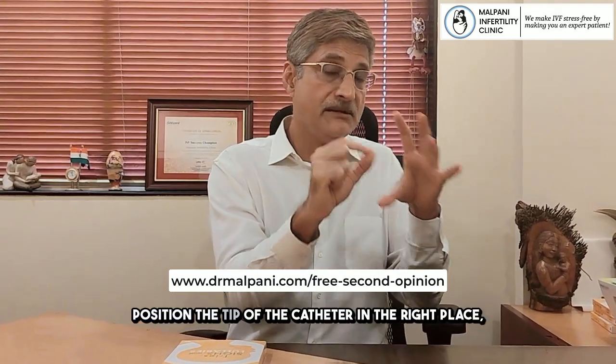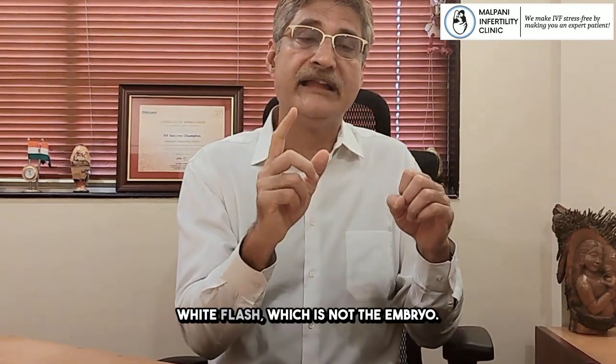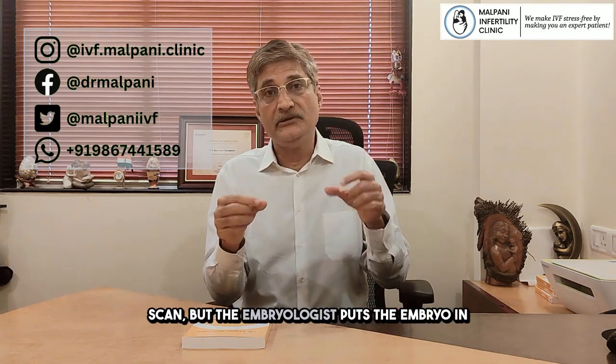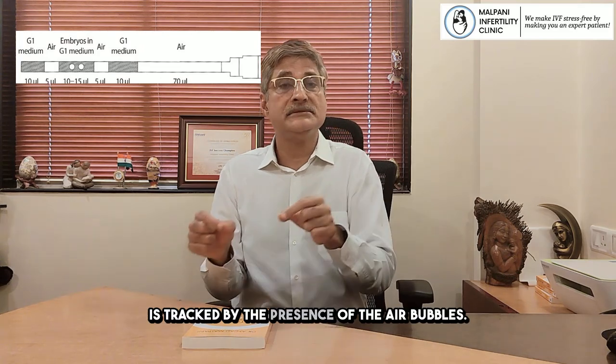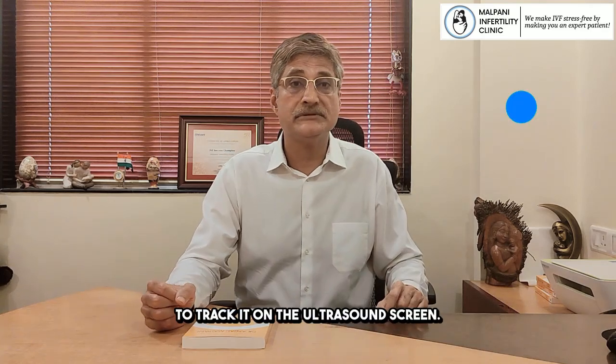we can position the tip of the catheter in the right place, and we can inject, and you can see a little white flash, which is not the embryo. The embryo is microscopic. You cannot see an embryo on an ultrasound scan, but the embryologist puts the embryo in air bubbles so that the embryo is tracked by the presence of the air bubbles, and air is echogenic. So it's easy to track it on the ultrasound screen.